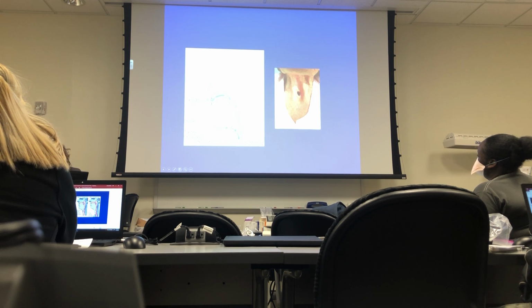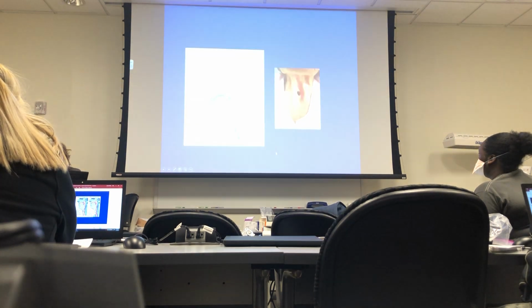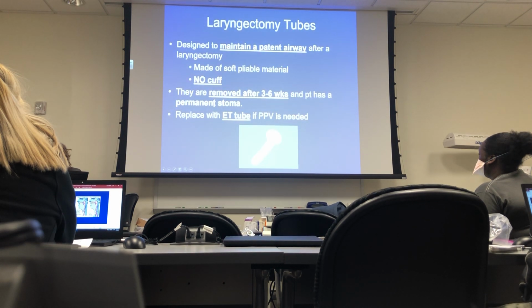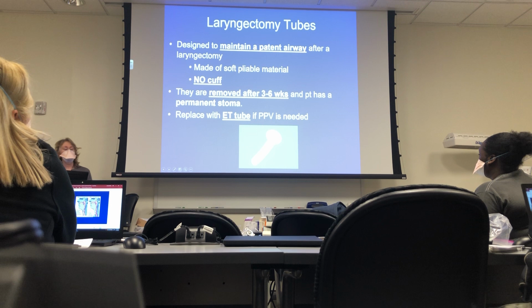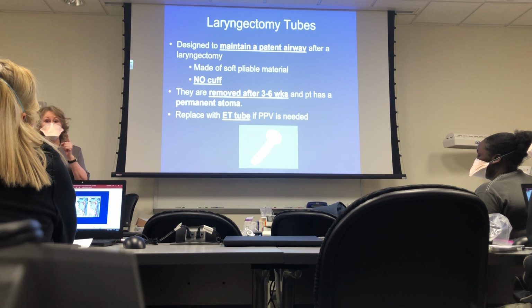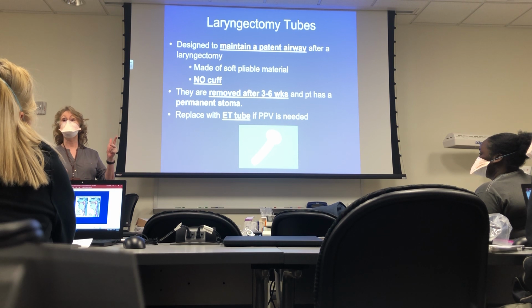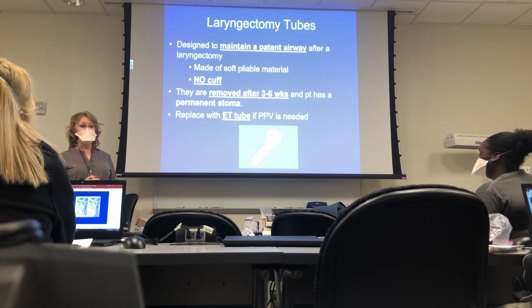So here they can eat, food goes down the esophagus, but their air intake is through that stoma site, okay? So the laryngectomy tubes are used post-operatively. Got it? Until that stoma site heals. And the key is, on the boards, you could be taking care of a laryngectomy patient, and they want to make sure that you know that there's no connection between the upper and lower airway. So when they say the patient needs to go on a ventilator, one of the selections may be intubate with an oral tube or intubate with a nasal tube. You cannot pick those because you can't use that. Put an ET tube in through the stoma, yes, that is what you would do. Okay? And that's the end.